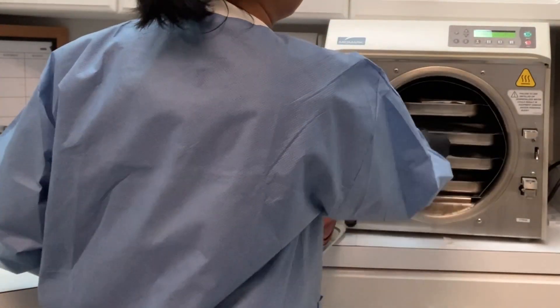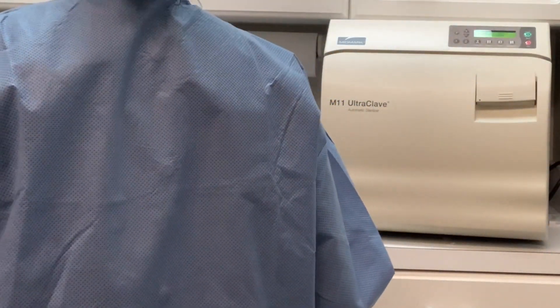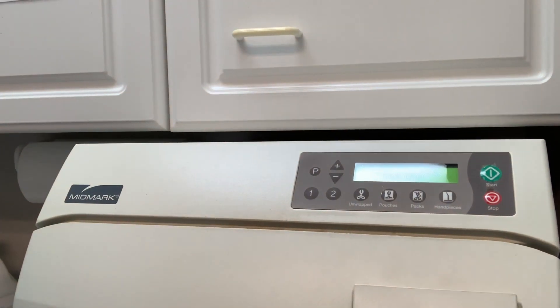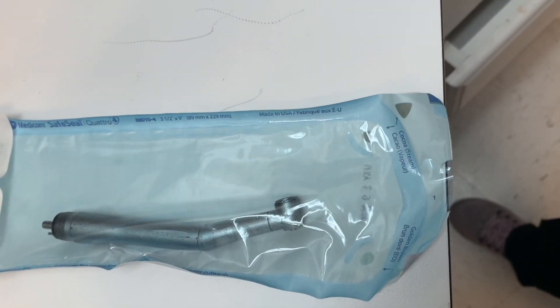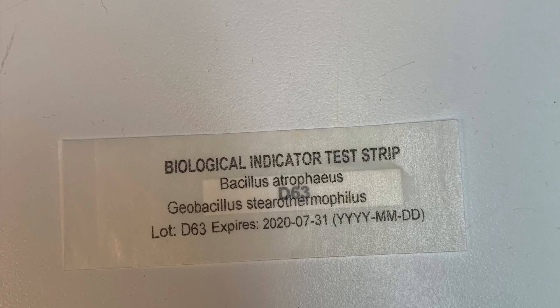Start putting your packages from the dirty bin onto the metal perforated trays in the autoclave. Place the packages such that they are not touching each other. You want a temperature of 250 degrees Fahrenheit at 15 psi. We always select 'pouch' as our option and hit start. Once the autoclave has done its job, the indicator turns black on the packages.